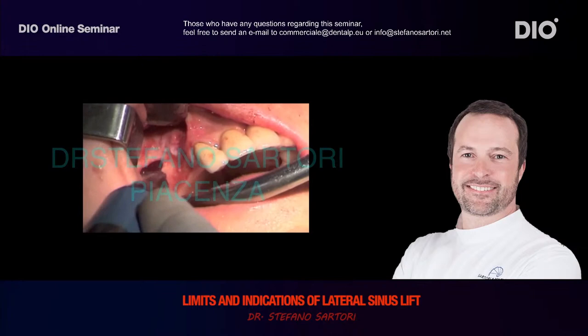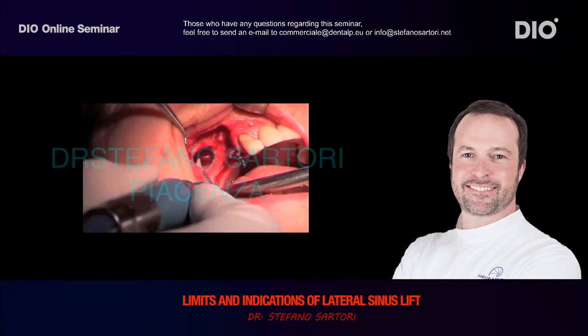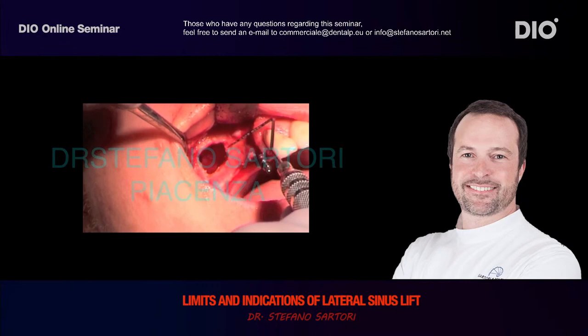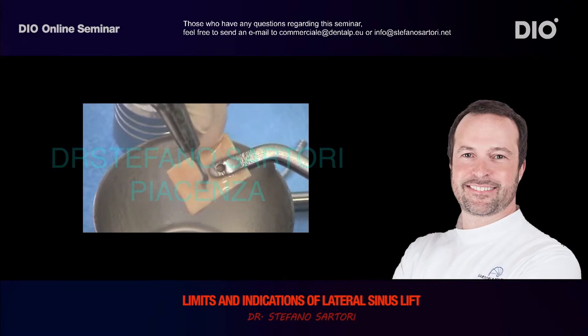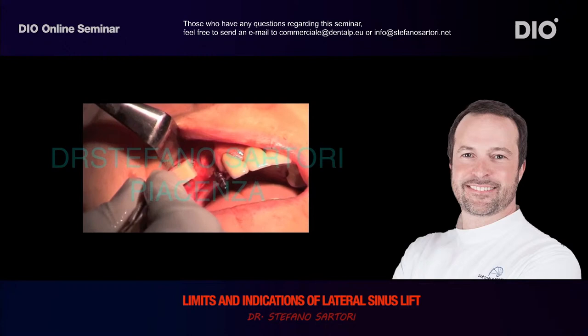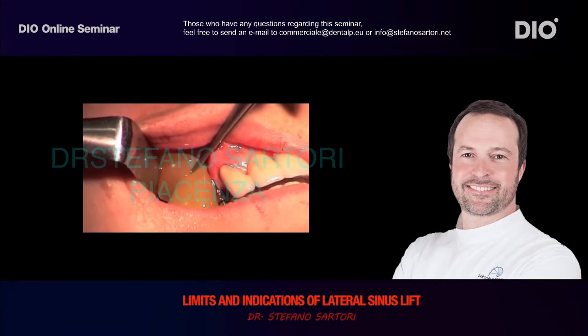Then you measure the cavity. You should design a squared perimeter with the piezo surgery instrument, and then you can prepare your block. Then the block is positioned with friction with a hammer. Its morphology is like a prism. So the friction of the block with the bone of the maxilla obtains a great primary stability, and it's very important. Here you can see the modeling of the bone. I try the bone, it's too wide, so I will modify it. But in this phase, you see the closure of the perforation of the Schneider membrane with many layers of PRGF.